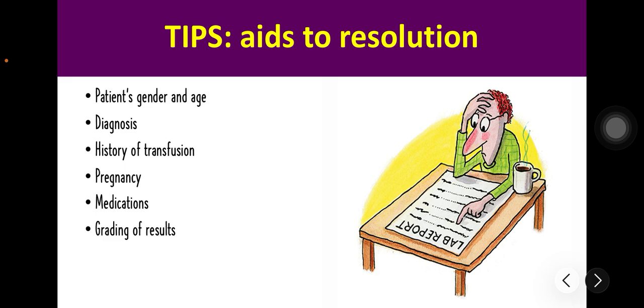For age, it's the most critical factor for group 1 discrepancies, which have weak or missing antibodies. Newborns do not produce their own ABO antibodies until 3 to 6 months of age, so any antibodies detected are maternal IgG. Conversely, antibody levels naturally decline in elderly patients, which may result in a missing reaction in the reverse typing.